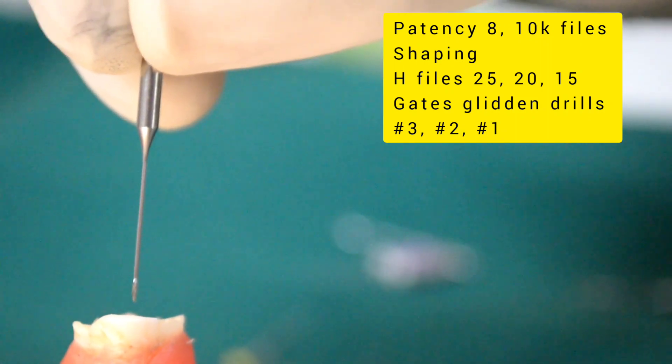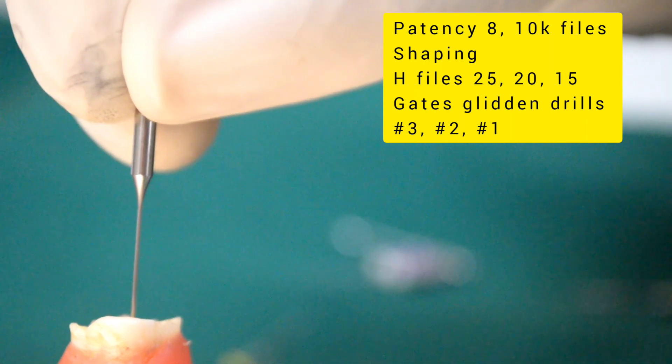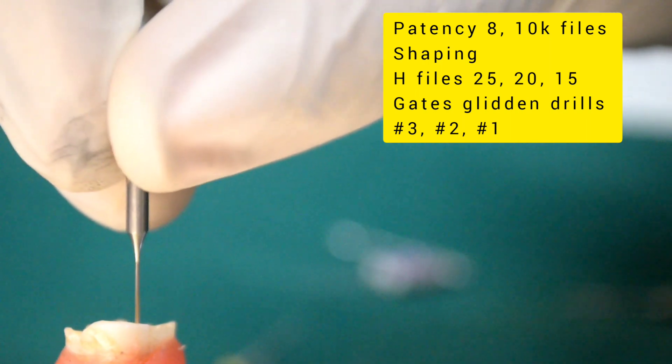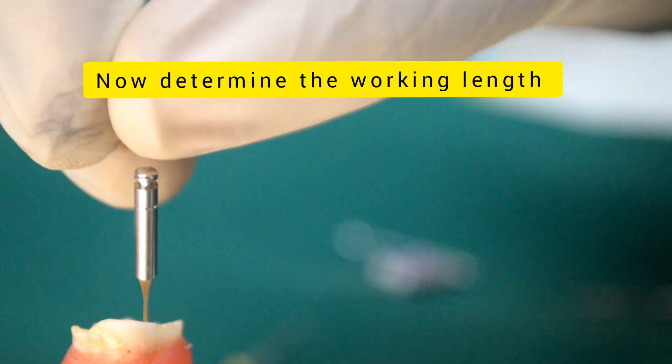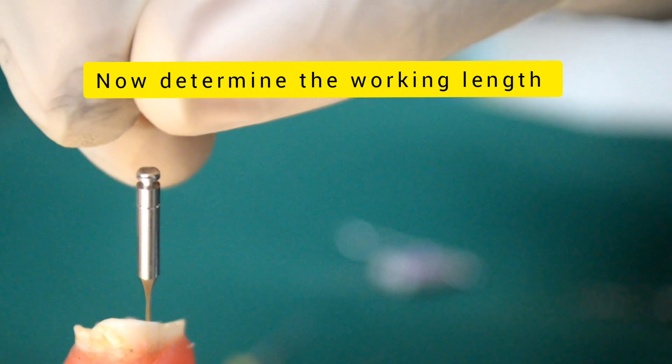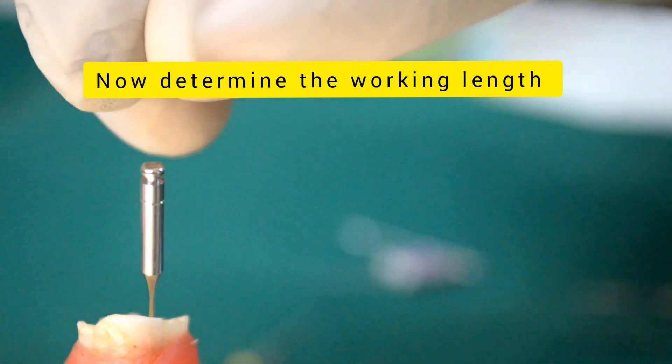Usage of GG drills from the larger size to the smaller size prevents the formation of Coke bottle appearance of the root canal. Care should be taken in directing the GG drills away from the furcation to avoid strip perforation of the root canals.